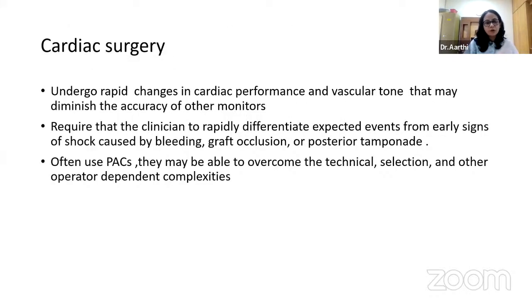And a few words about hemodynamic monitoring in cardiac surgeries, because cardiac surgery patients undergo rapid changes in cardiac performance and vascular tone that may diminish the accuracy of other monitors and requires the clinician to rapidly differentiate between early signs of shock like bleeding, graft occlusions, and tamponade. These are areas where PACs play a major role, where technical and selection limitations can be overcome because they are used very frequently and clinicians are more familiar with pulmonary artery catheter techniques.